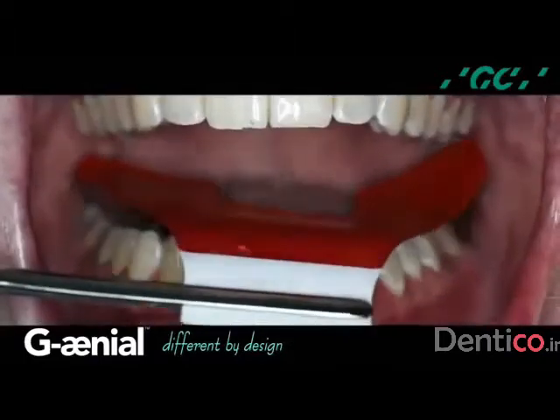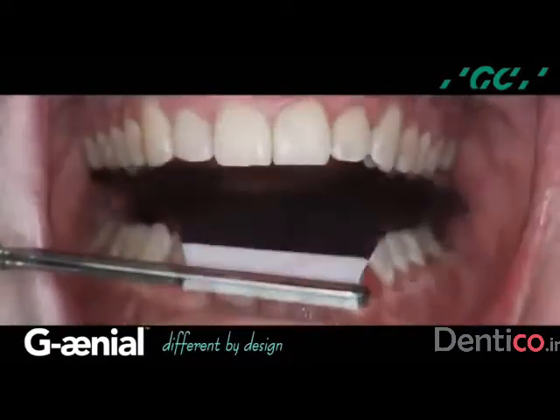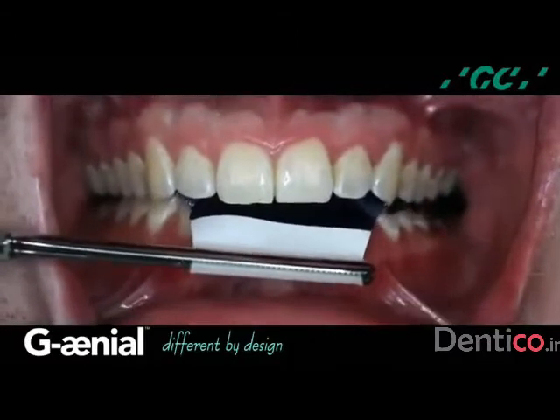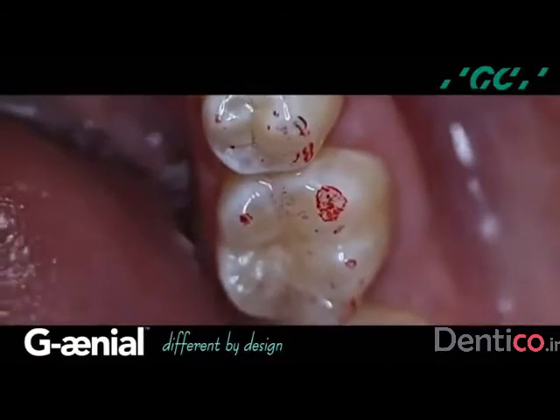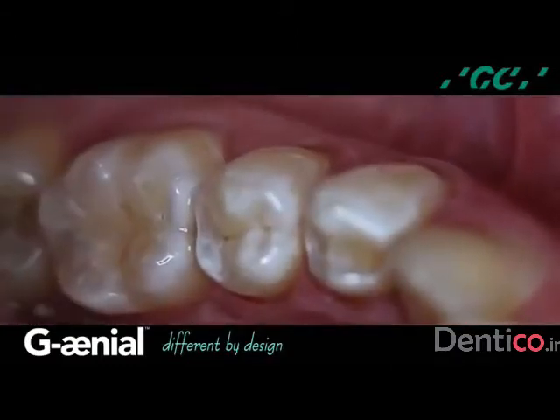The occlusion is inspected with the patient in an upright position in centric occlusion, and inspected for any prematurities in protrusive and lateral excursions. And the completed restoration displays function with an optimal integration of anatomical form and color.